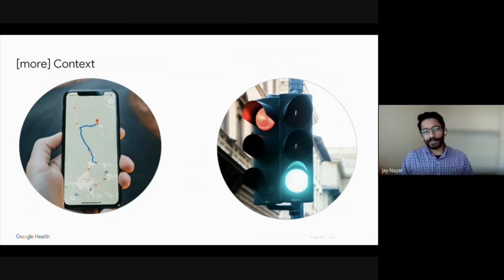But sometimes this data by itself will not have the whole picture or consider the context in which the device is being used. This is where applicability of the data comes in, and each variation should be evaluated for validity. Thus, regulatory surveillance and real-world performance monitoring are related and influence each other, but they're not the same.